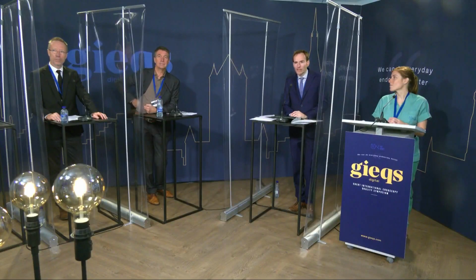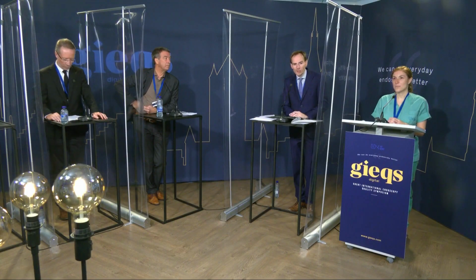We will have a live case and a few very interesting lectures. The session will be co-moderated with Dr. Anderson from Cheltenham, who is in the UK, and Professor Lobaton, who is already in the live endoscopy room and will guide us through this case. So I suppose that we move to the endoscopy room to see a first case by Dr. David Tate, who will tell us how to approach patients with a suspected upper GI bleeding.